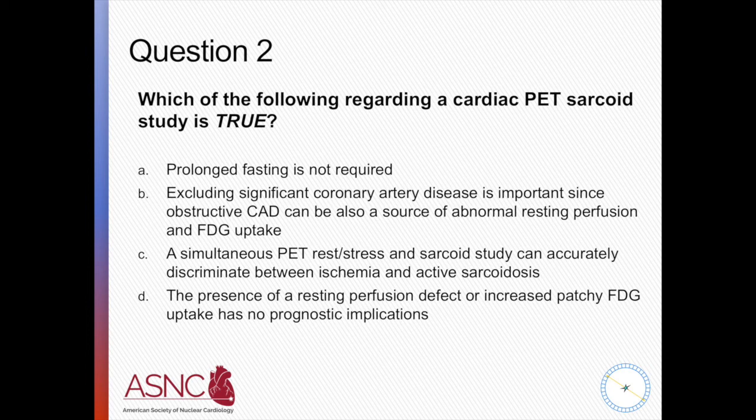So prolonged fasting is one of the most effective strategies to optimize the PET sarcoid study. There are some other strategies, like the addition of a high fatty meal, as well as the use of heparin, as we touched upon a little bit in the presentation. So prolonged fasting is required.